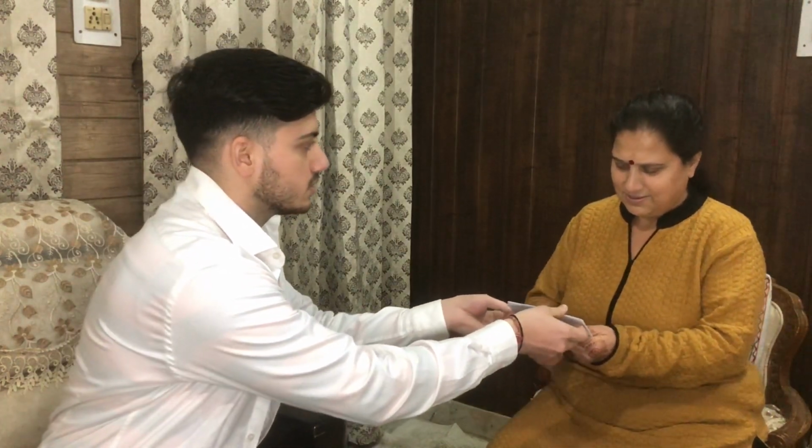After the examination, note down the score and start with the Jaeger near vision test. And for that we will be giving Jaeger's chart where the size of the letters are associated with the inches between the card and the eye. Note down the results and start with external eye examination.